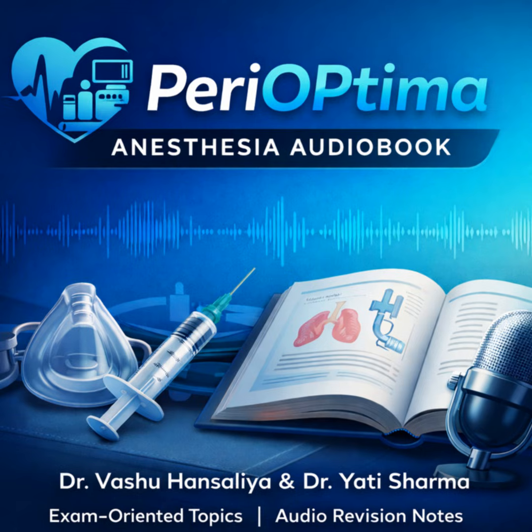Okay, so define the core mechanism of the proportioning system, or the hypoxic guard. It's a mechanical or pneumatic linkage that ensures the oxygen flow is always proportional to the nitrous oxide flow. So it physically stops you from turning up the N2O too high without enough O2? It does. The system will not allow the N2O flow control valve to be fully opened unless the O2 flow control valve is opened commensurately. It physically or pneumatically imposes a minimum ratio.